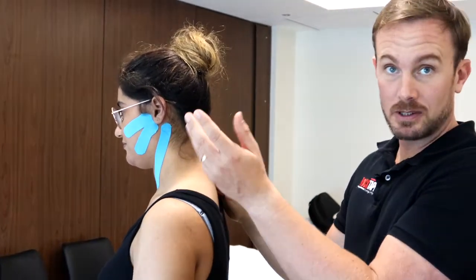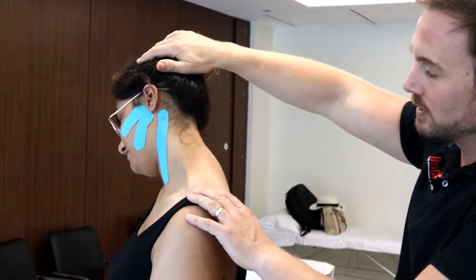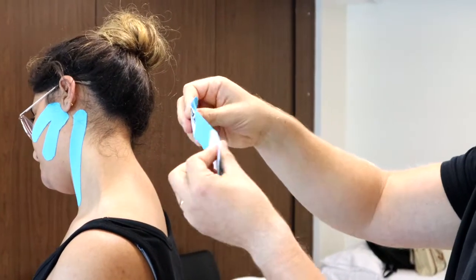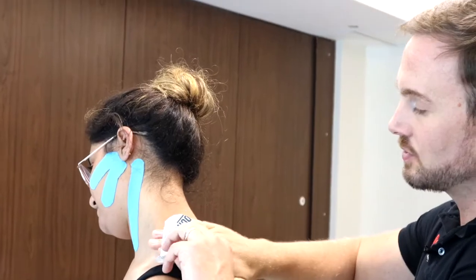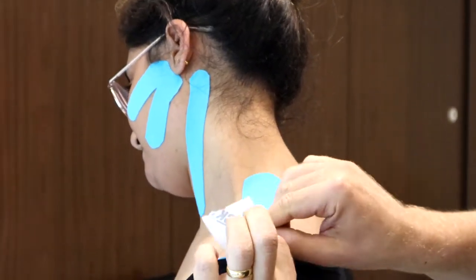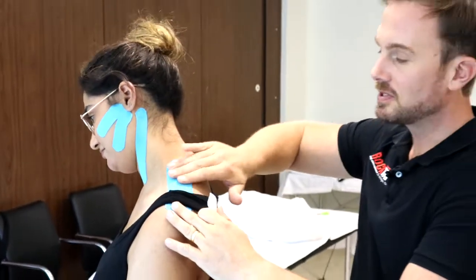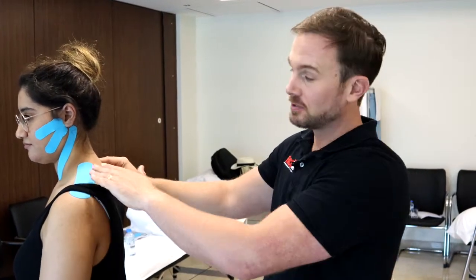If neck tension can contribute to TMJ dysfunction and jaw tension, then it makes sense to do some taping for any evident neck tension. So we're going to come down now onto the upper trapezius. We get our patient to stretch across a little bit forward into flexion, stretching the upper trapezius region. Taking some tape — five centimetres in width, cut to go over the upper trapezius — starting on the base of the neck and then sticking the tape down without any stretch over the upper trapezius, running it down so we don't stick it to the clothing. Rub to stick. Because we stretch the patient and not the tape, we're hoping this tape will encourage a bit of relaxation and a feeling of offload for this area.